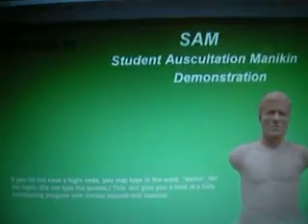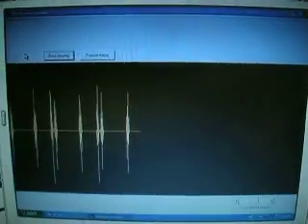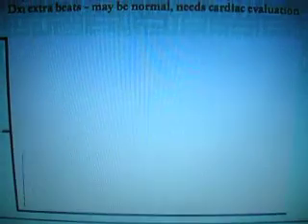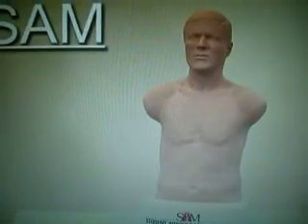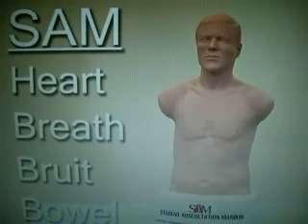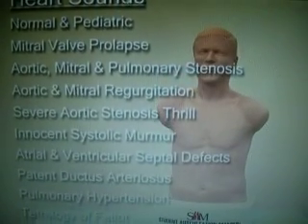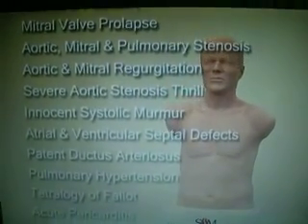Three new enhancements expand this skill: SAM Online, SAM View for visual display of sounds, and the Pulse Training System. SAM presents heart, breath, bruit, and bowel sounds at the correct anatomical site. SAM has more than 33 heart sounds, complete with the ability to palpate a murmur or thrill.